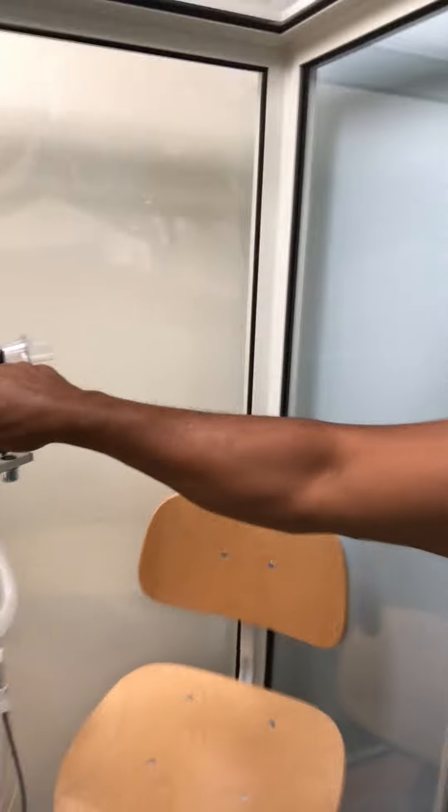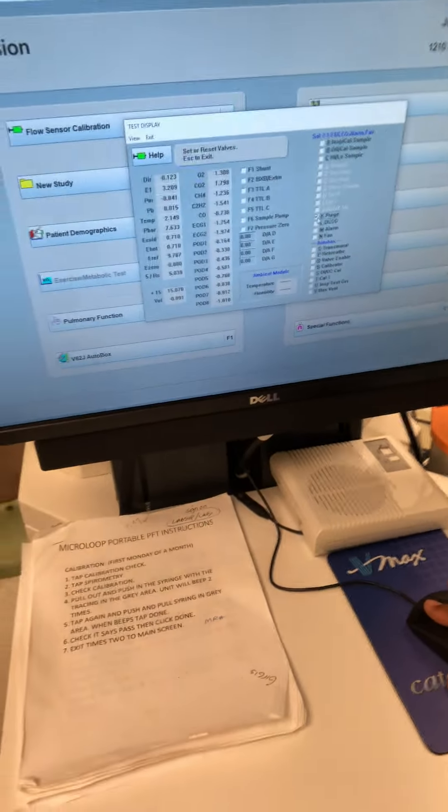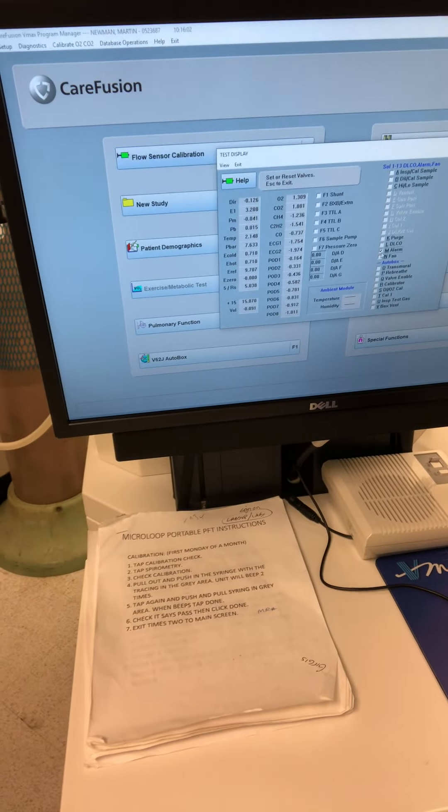These diaphragms are very important to replace during the PM. Of course, you want to get into the diagnostics of the unit to be able to activate all the different valves — that's the way you start to check them. So as you control the body box from here, these are all the valves and all the functions.